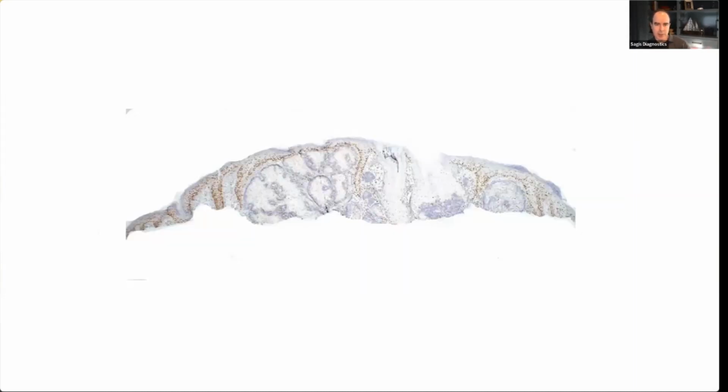So we did the DNA mismatch repair enzymes. And in this case, a loss of the staining is what's abnormal, because the enzymes don't match up to the antibodies. And so you can see that that's an abnormal enzyme in this patient. So keratinocytes normally have DNA mismatch repair enzymes intact. So you can see the keratinocytes are positive, but the actual sebaceous neoplasm is negative.